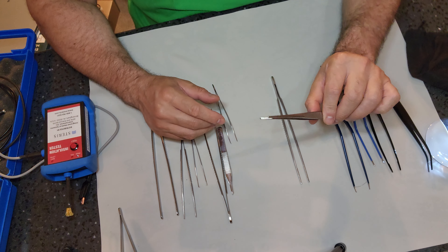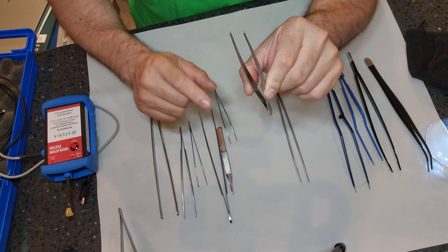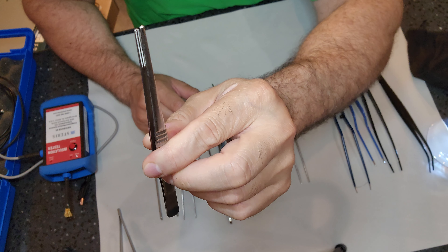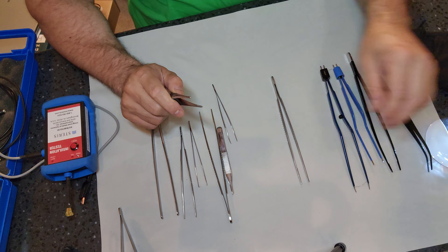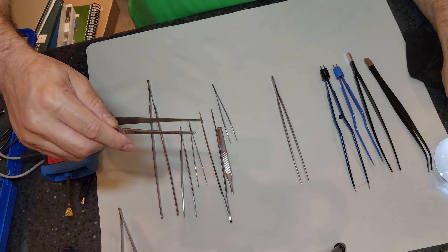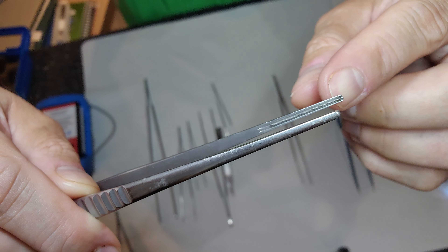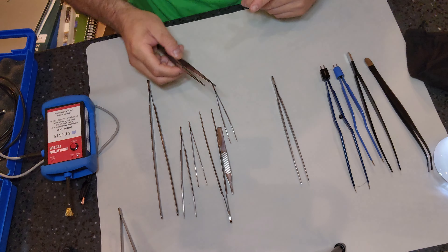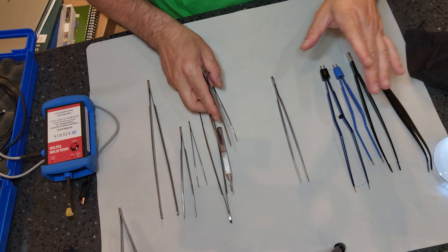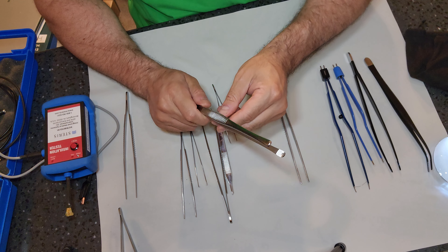Always start with the easiest, so you should have started with your alignment. Bring the forceps together, make sure the jaws align and that they're locking into place — that one isn't bent or cockeyed. If you've got cockeyed forceps, it's a bad forceps. You definitely want to inspect the tips. The DeBakeys get really, really dirty — that tip right there in the corner has some coagulated blood on it. You don't want to find a brush from decon and brush it off — this goes back. For all your forceps, inspect the same exact way: make sure the tips align and check for cleanliness.